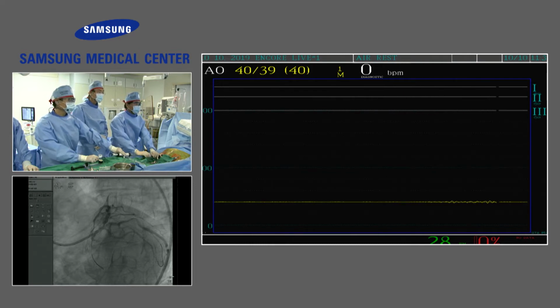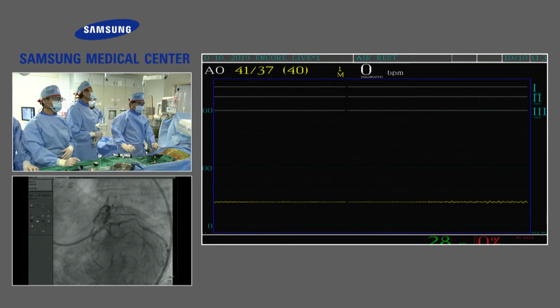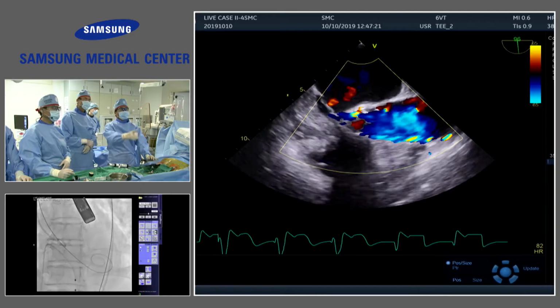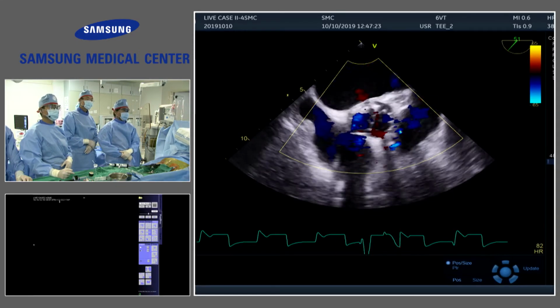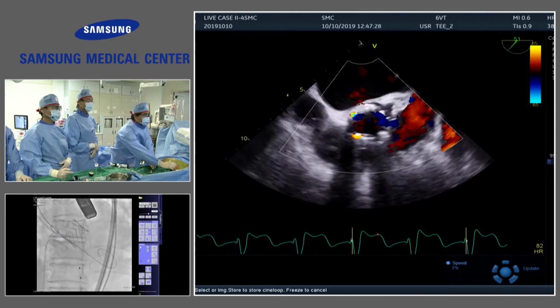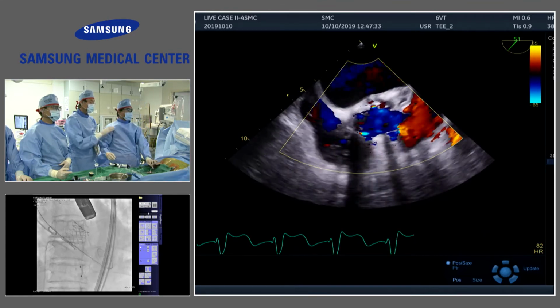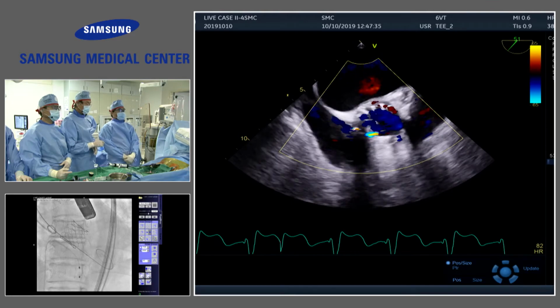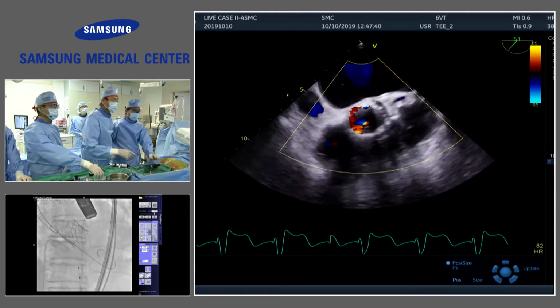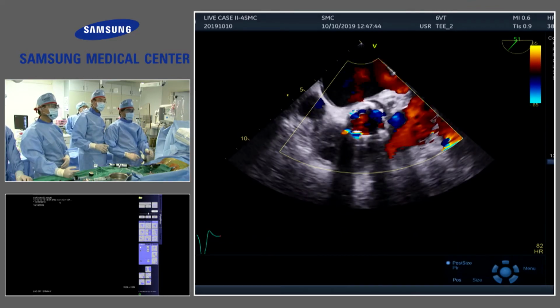Okay. We want to see the angiogram, and if it is available, show us the post-harbor pressure wire in the LAD. It is really interesting. Angio? Asking me? Okay, test. Angio test. Blood pressure is low. No, not yet. Can we see the blood pressure?